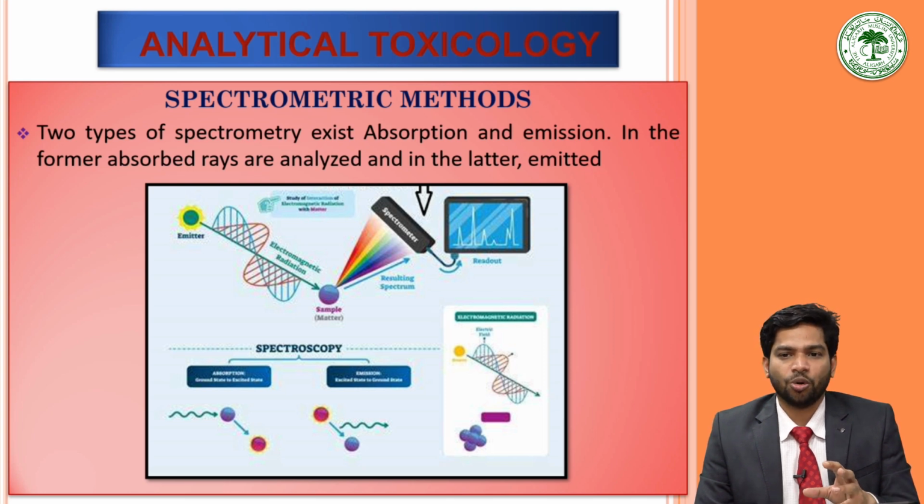Spectroscopy is the direct viewing of the spectrum, that is, scope means the viewing. Spectrometry is the measurement of the spectrum, that is, metron means measure, by an analyzer. Then spectrography is the photographing of a spectrum, like in mass spectrography, from the spectrum and the photography. In practice, there are two types of spectrometry.